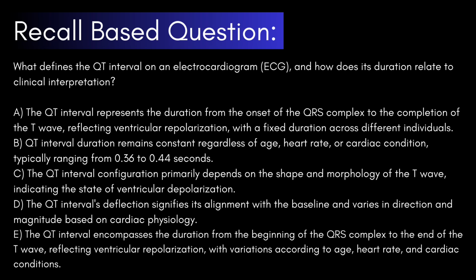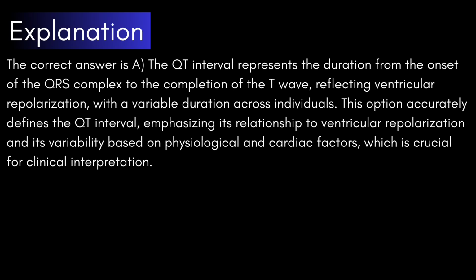All right, I think I gave you guys enough time here. I'm going to move on to see what the correct answer is and what the reasoning behind it is. If you need more time, feel free to pause the video. Otherwise, moving on now. The correct answer is A.